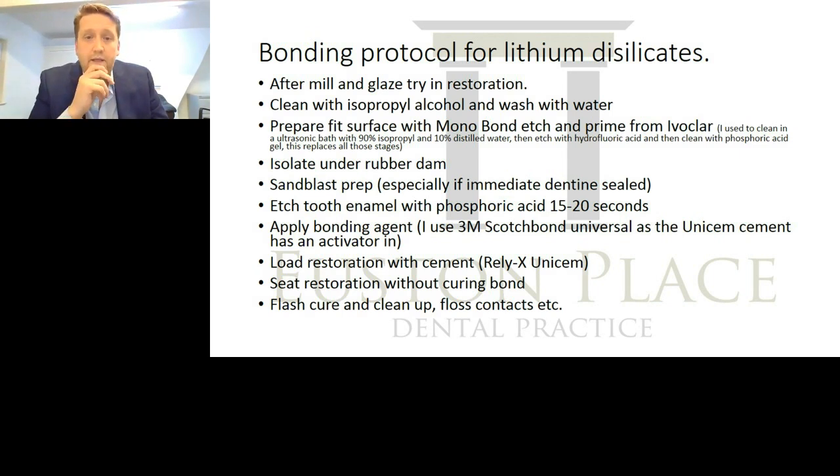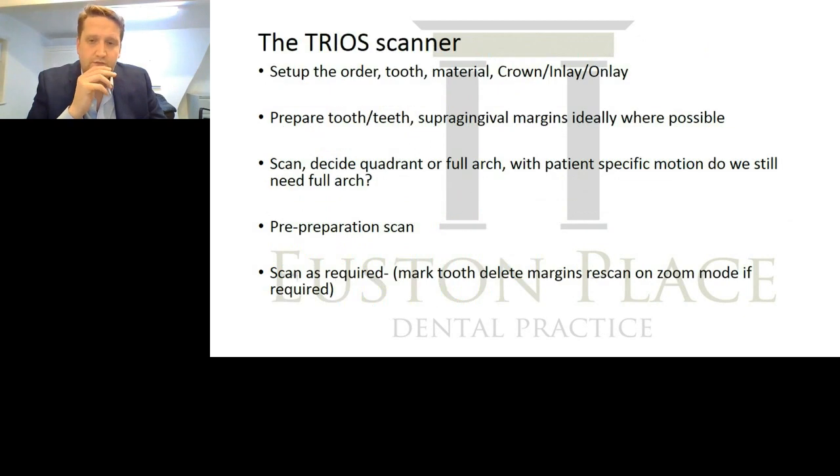And then the setup of the order. This is some information about the Trios scanner. So you set the order, materials, and that will all transfer then straight to the Trios Design Studio.